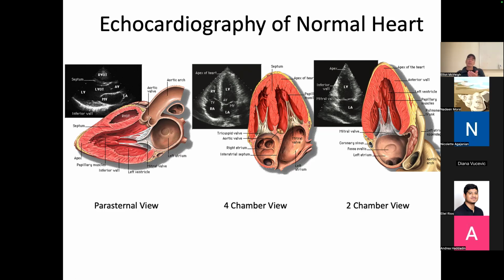And now I have two other segments of the left ventricle, this one and this one, where I can evaluate the muscle function. So now I have 1, 2, 3, 4 different segments of the left ventricle of that cone to evaluate whether or not the muscle is contracting. And I'm looking at the mitral valve again and the left atrium. So these two views are very important for just general cardiac function. How is the heart doing? Is it contracting well? Are the valves operating well, etc.